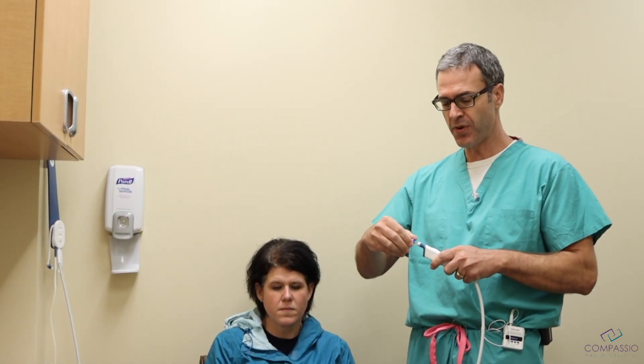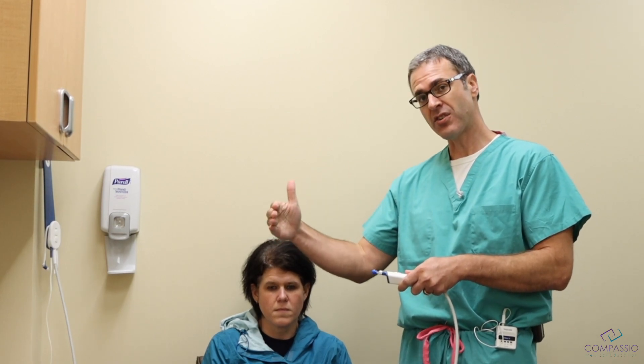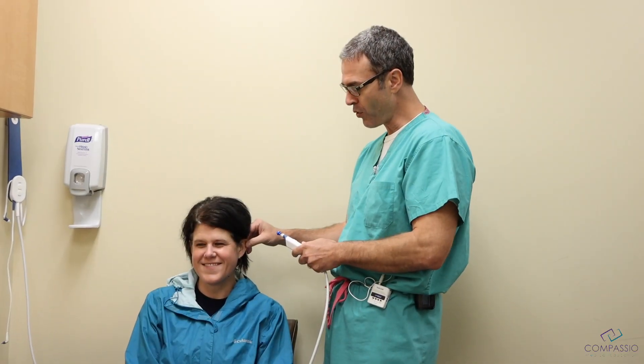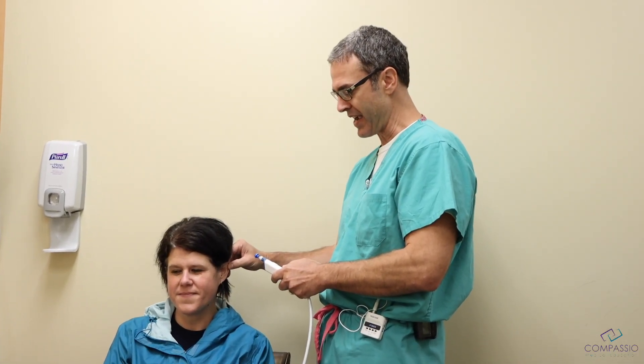We put that onto the probe, and once we put that on, we'll lift up the ear and insert this into the ear canal. It'll send a little pressure and a sound wave, and that sound wave will move the eardrum. You pull up on the ear right here — up and back.